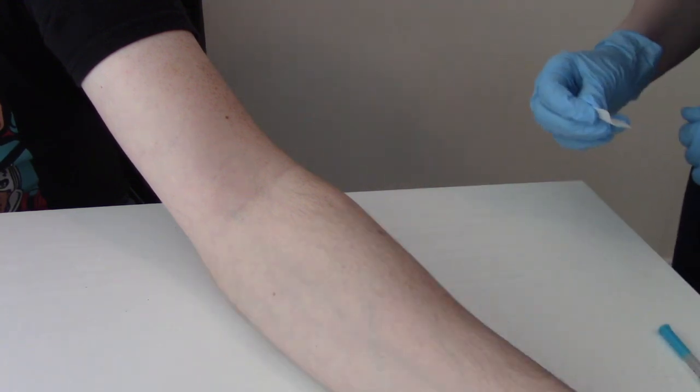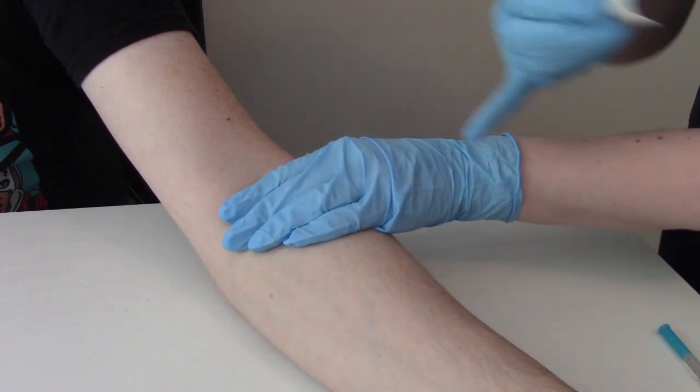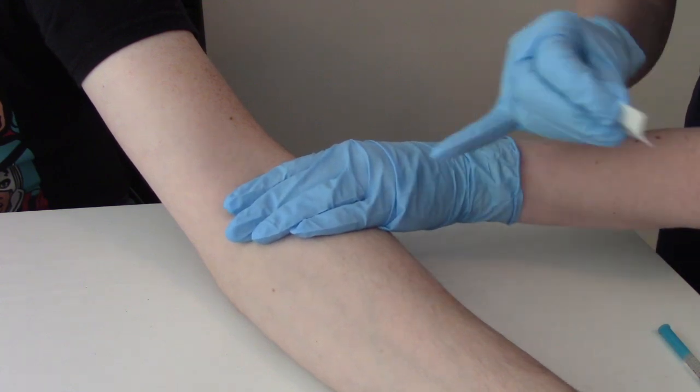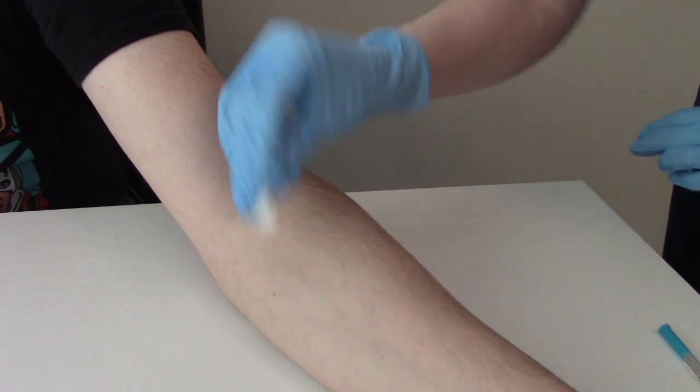Now we're ready to do our intradermal injection. To find the location, you're going to go one, two, three, four fingers down on the forearm, making sure that the patient's arm is flat and resting on a surface like a table. Then about this point, you're going to wipe it.